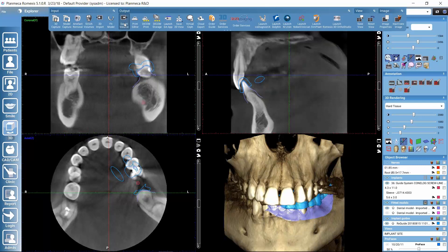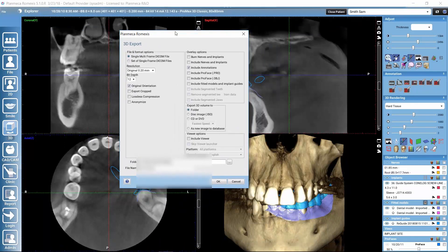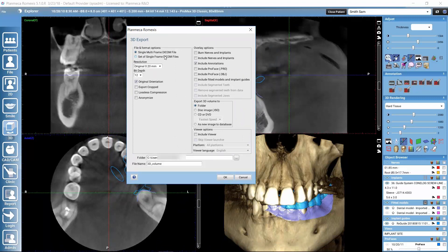One more thing: we can export this volume. Once we have a 3D volume opened, we select Export in the upper toolbar. Here we can choose how to export the opened volume — we can select the format and resolution for the export. There are also options for whether to export with cropping applied or using the original orientation from capturing. We can also compress the volume to reduce file size and anonymize it by removing all patient information.